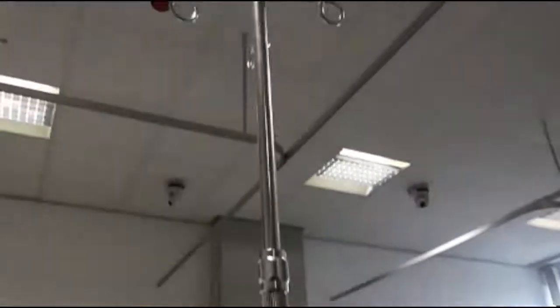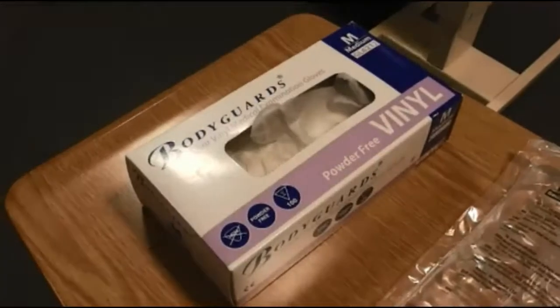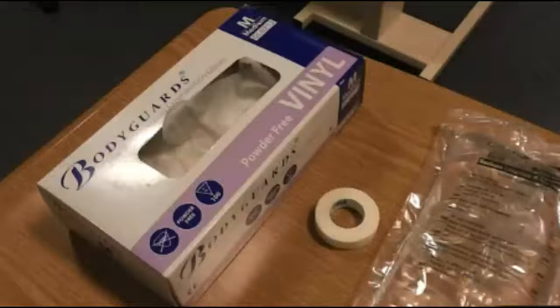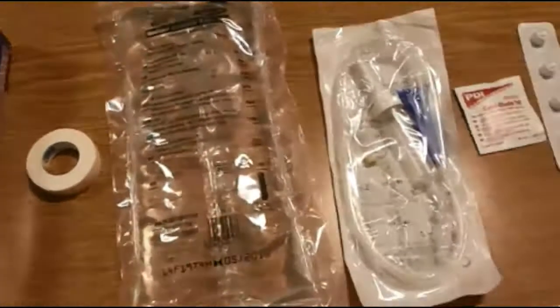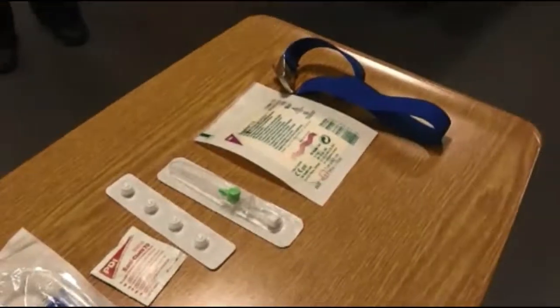Not all of this is visible in this video, but when you go into practice you'll probably see a drip stand — the same applies during a simulation or scenario. You'll also see a bag of fluids that will be in date for the simulation. You'll have your gloves, fluids, giving set, cannula cap, and tegaderm. In practice you'll have a greater array of items, and you'll follow local trust guidance relating to these.